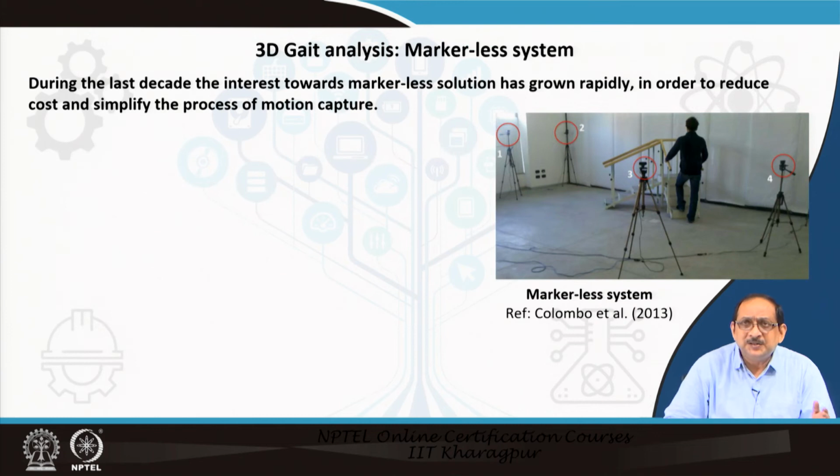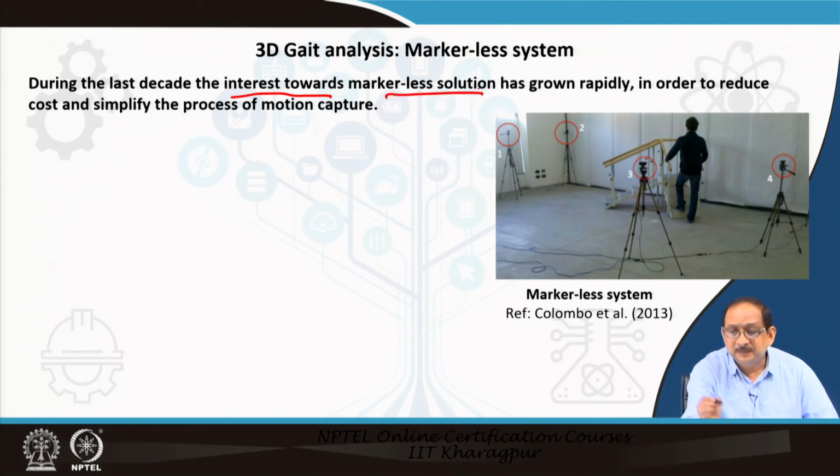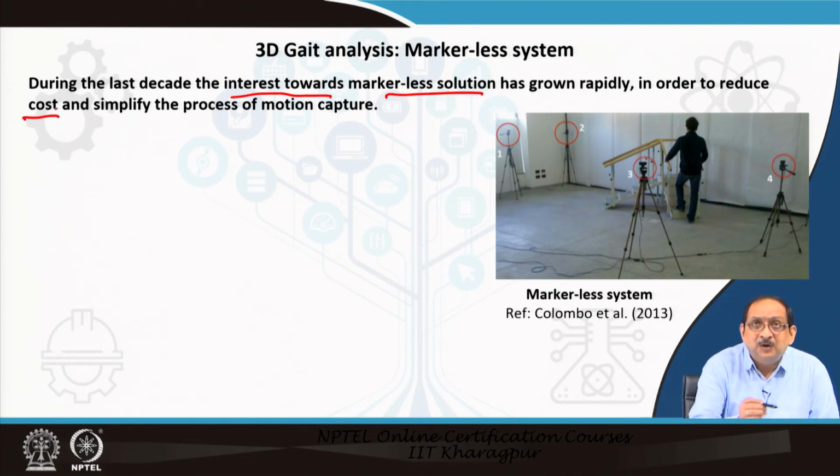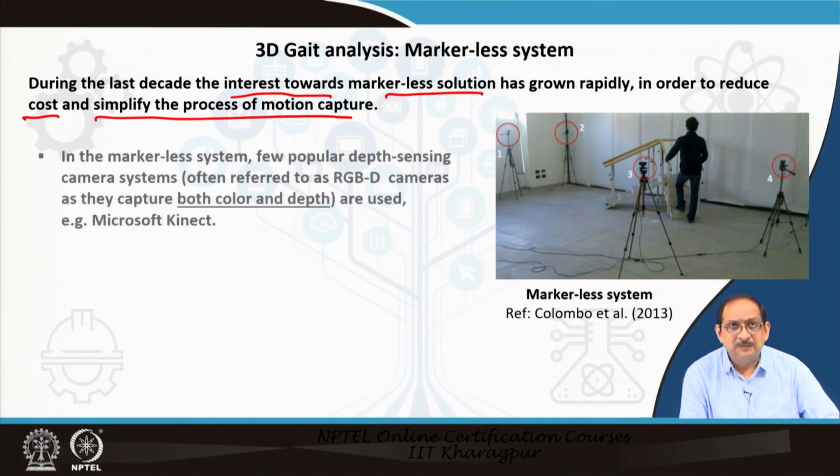Now, let us discuss the markerless system. During the last decade, considerable interest has been shown towards markerless solutions in order to reduce the cost involved in marker-based systems and to simplify the process of motion capture. On the right, you can see a markerless system with 4 cameras shown in the figure.